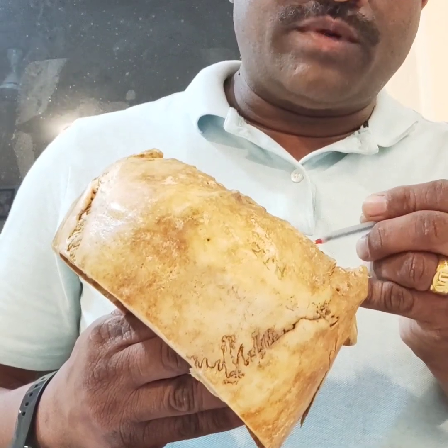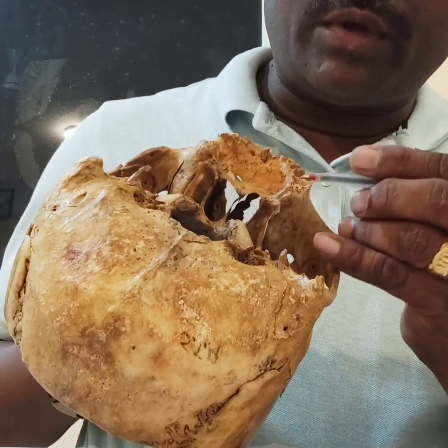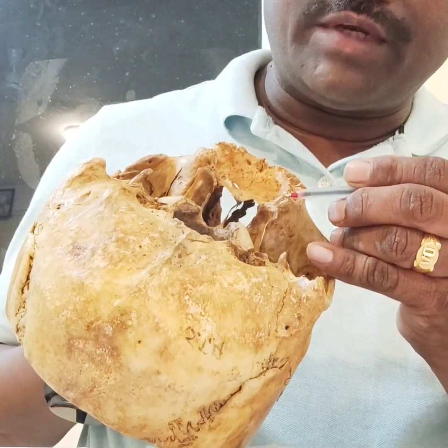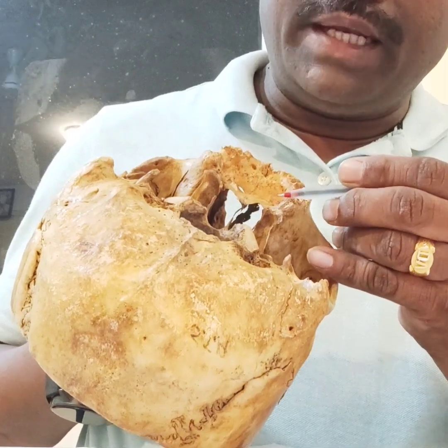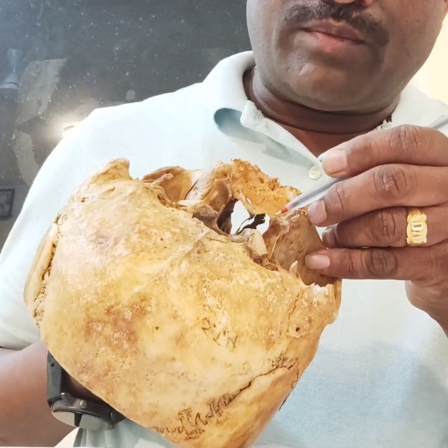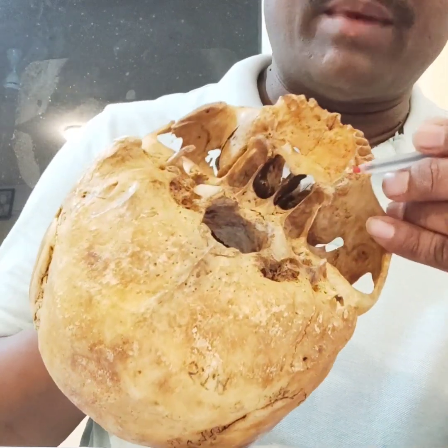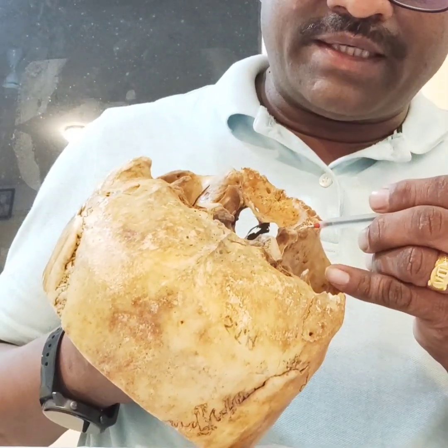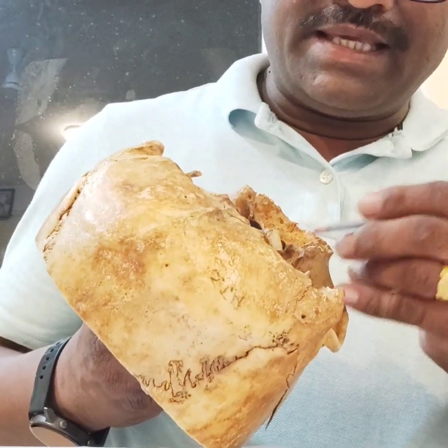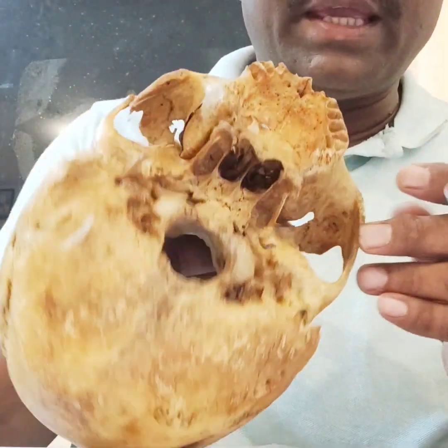When the tuberosity is good, when you have the bulk of tuberosity, you can start from the buccal aspect of the tuberosity, angulated 15 to 20 degrees medially and distally, and proceed with the osteotomy. In pterygoid implant placement, it's a blind technique. I call it a blind technique because nobody perfectly knows where exactly the fusion zone is. The fusion zone is the area where you are going to engage your implant.